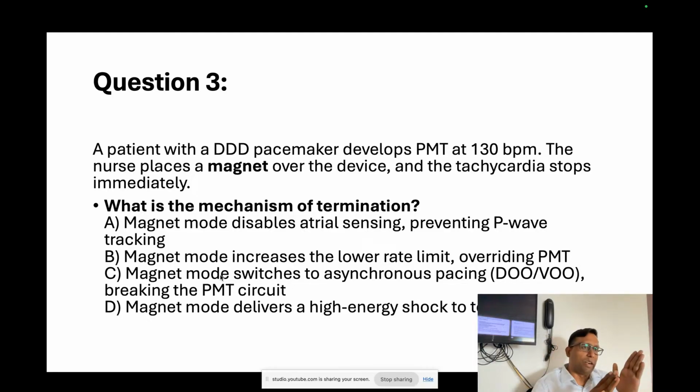But a ventricular rate of more than 200 is still possible in atrial fibrillation with fast ventricular rate. So it is AFib for which you are giving shock. So the device is not supposed to give shock for atrial fibrillation. It is only and only for VF or the VT which is unstable. Unstable means the patient's blood pressure is dropping. In those two conditions, it should start with a default shock mode.